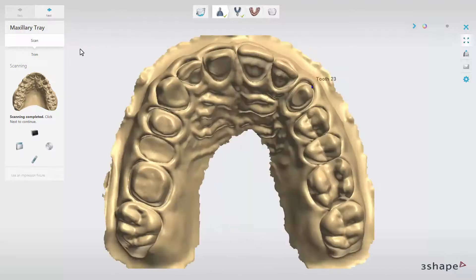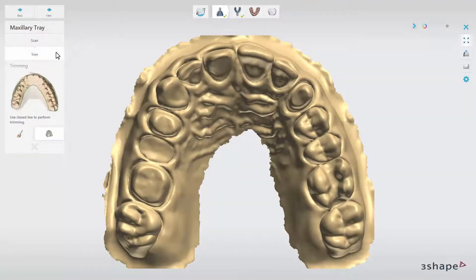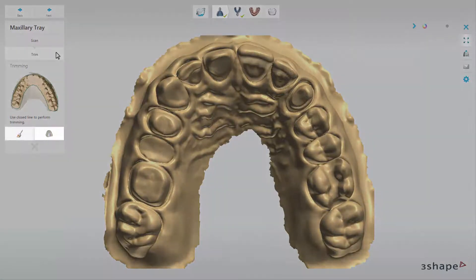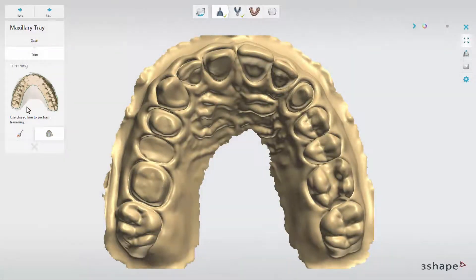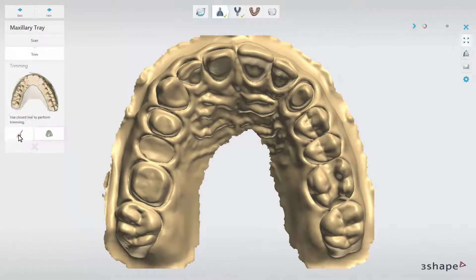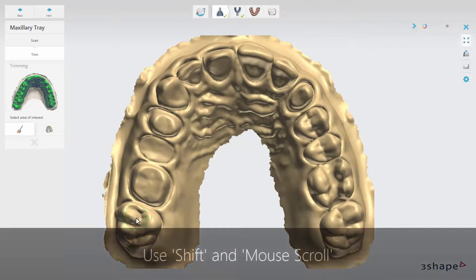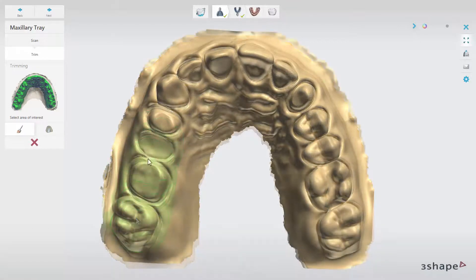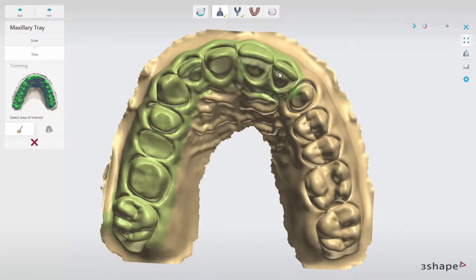When ready, you have the possibility to trim scans to reduce the amount of data that will be carried over to the dental system. Use either selection or line mode for that. When you use selection mode, paint over the area of interest and use Shift and the mouse scroll in combination to change the radius of the tool. Remember that you have the possibility of free movement between steps in the workflow bar.